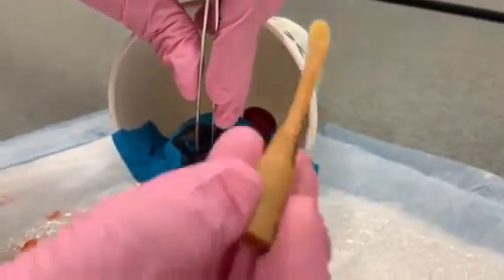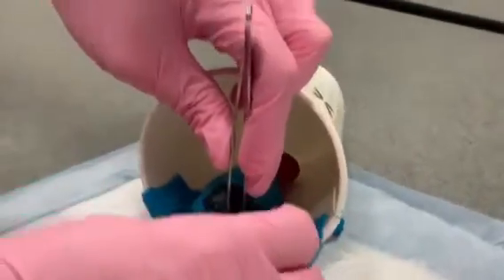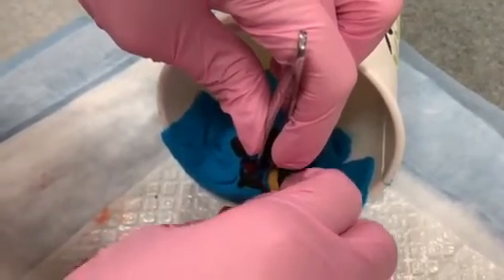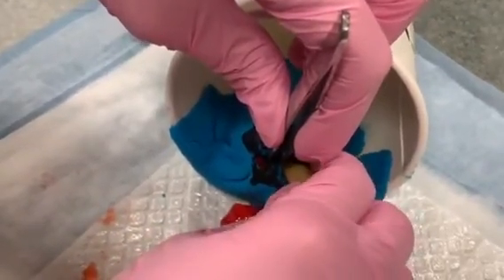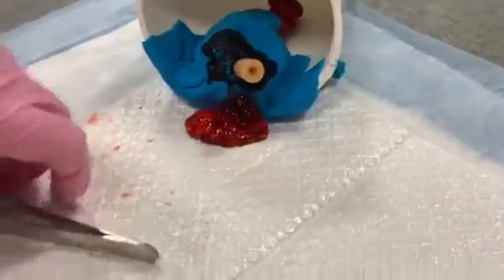This is how the Word catheter looks. At the end there is a balloon. You want to insert it into your incision site and it should fit into the cyst wall. Once it's in place, you will proceed to inflate the balloon.